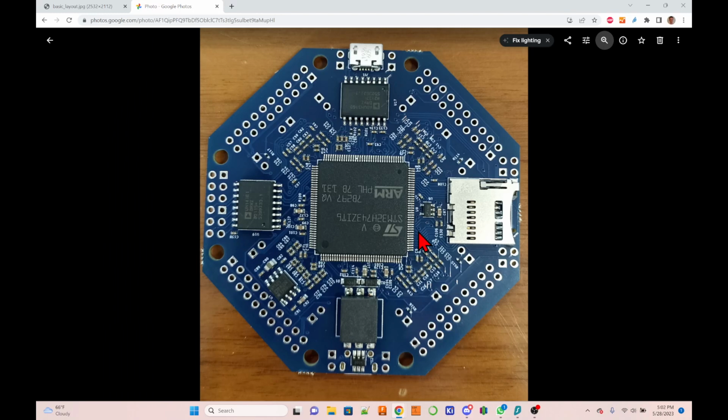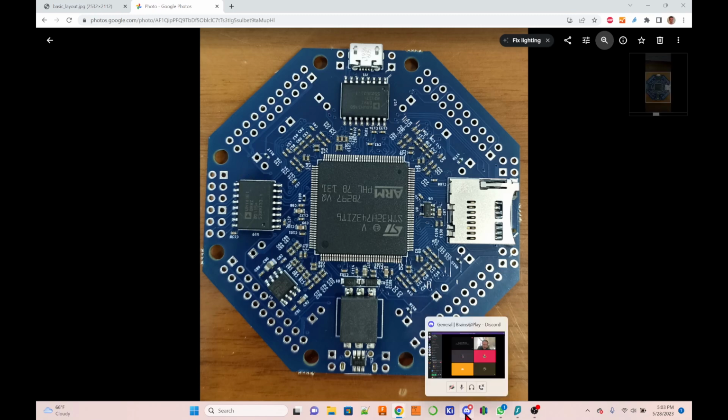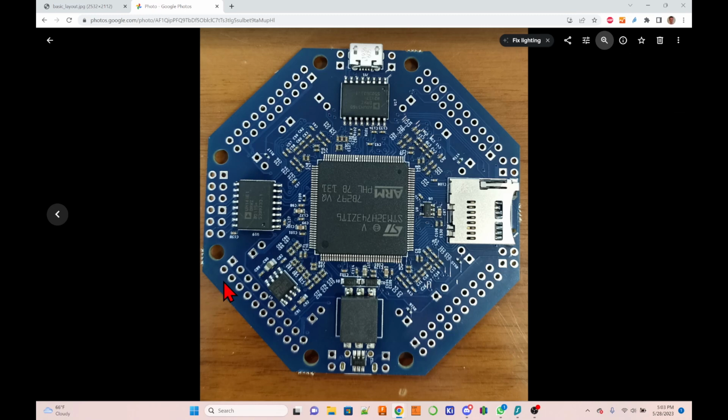Yeah. All right. So if you want to interconnect multiple boards, you need to do two things. One is you need to solder header pins, which on one side are male and on the other side are female. I don't have a DigiKey link to that right now. Maybe Dimitri, if you're still listening, you can find on DigiKey a 2x1 header pin that interconnects the boards. And of those, you need in total, what, 11? Yeah, you need 11 of those. Or I would recommend soldering all 11 of them.